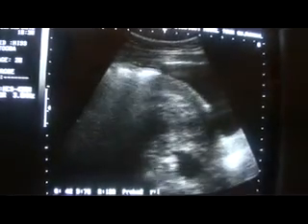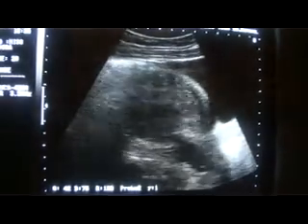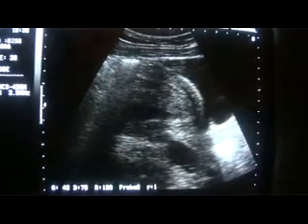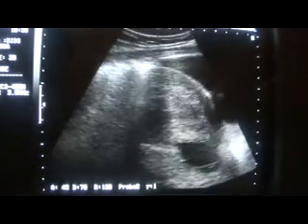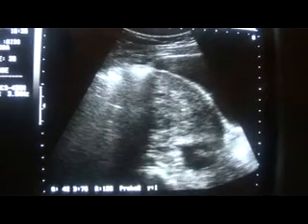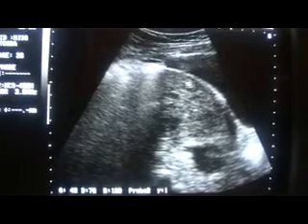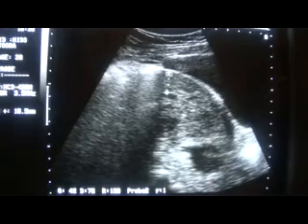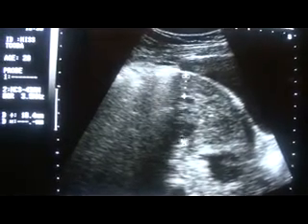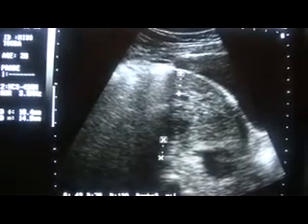Now the right ovary is not clearly differentiated, trying to do so.